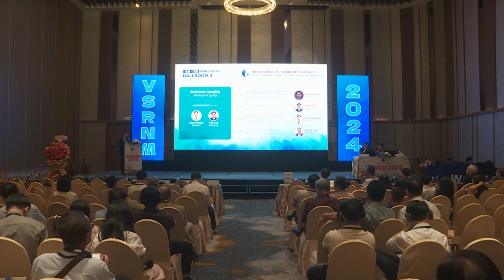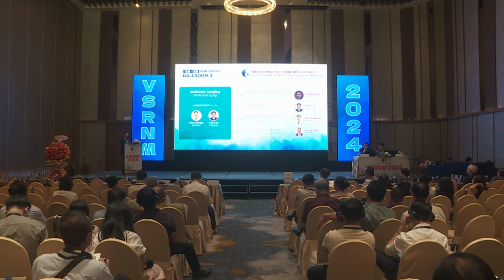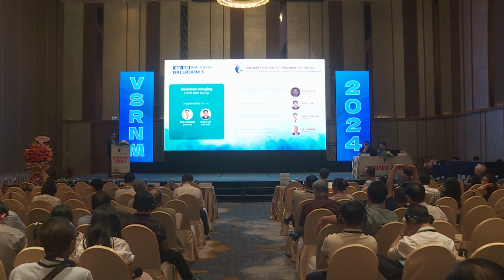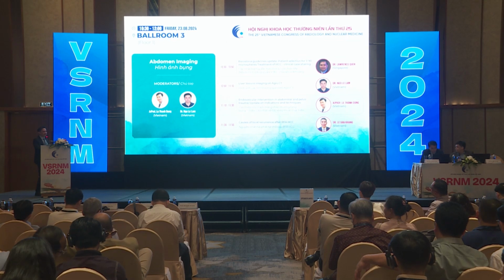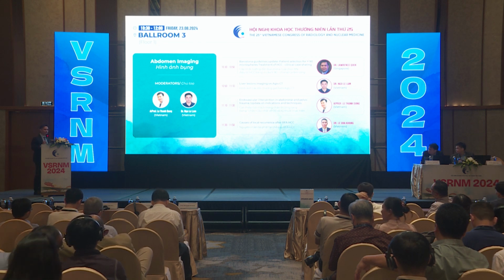Actually, we used both compounds. We started our practice using SIR-Spheres, and we were proctored, and then after that we moved on and used TheraSphere, because Boston Scientific bought over the company and then came over to Asia and decided to set up. So there are benefits to both, so to speak, because the SIR-Spheres plant is in Singapore, so you can get access immediately, whereas for TheraSphere, we have to wait about 10 days for the dose to come in.